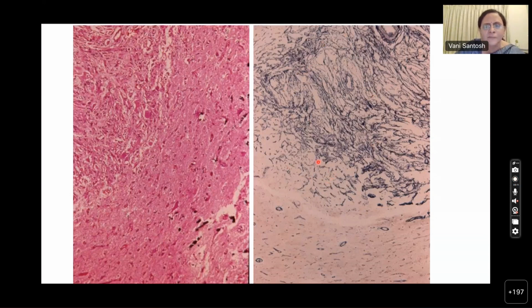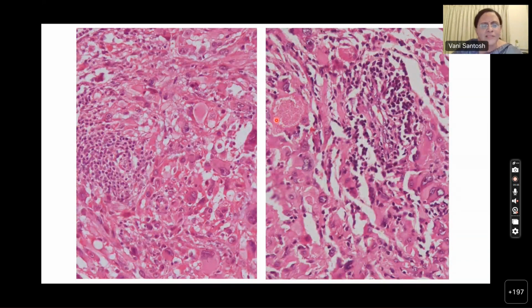Again, a very useful stain. And the tumor shows dense reticulin fibers in the background. And you can see now so beautifully it is circumscribed, and it has a good pushing margin from the rest of the parenchyma where only the blood vessels are reticulin positive. But here the tumor has intrinsic positivity with reticulin. Now you describe. Now this is easy.